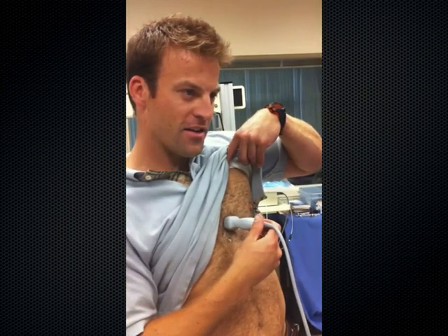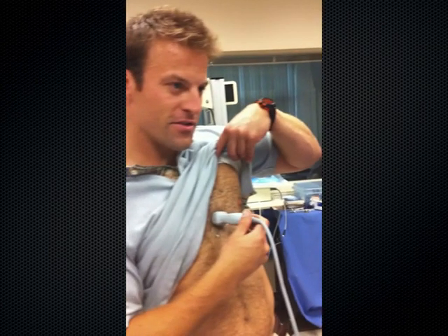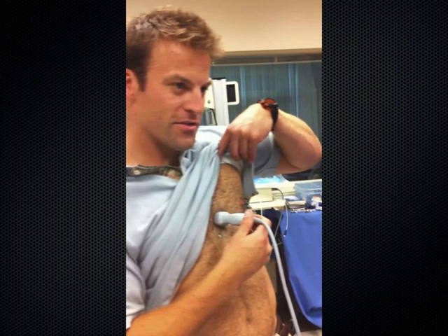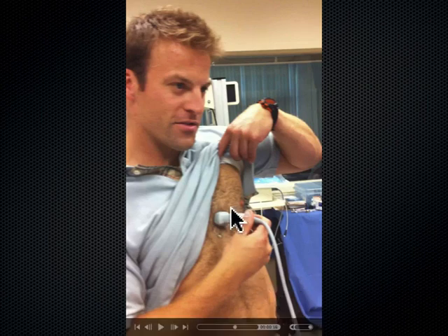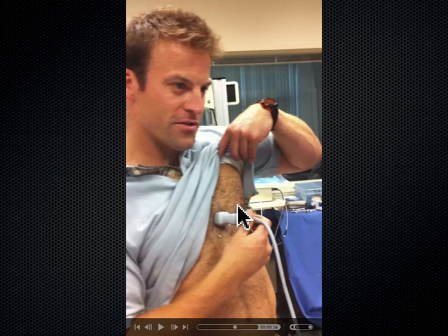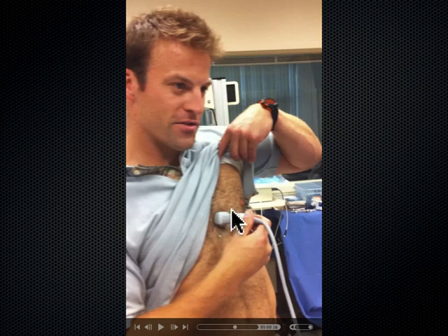That's Eric Mervis, one of our residents in the emergency department. When I first saw him do this I thought he had really wide-spaced nipples because the probe is so far from his nipple. But really it's because he's standing up and the heart shifted more medially in his chest. This is why when we do this on patients, we lay them flat and roll them left lateral decubitus — that makes the PMI come out to where you'd put the probe.